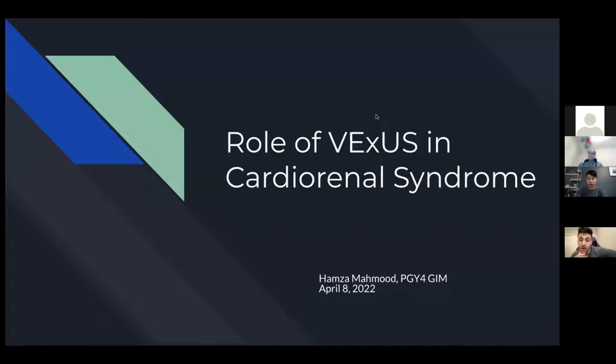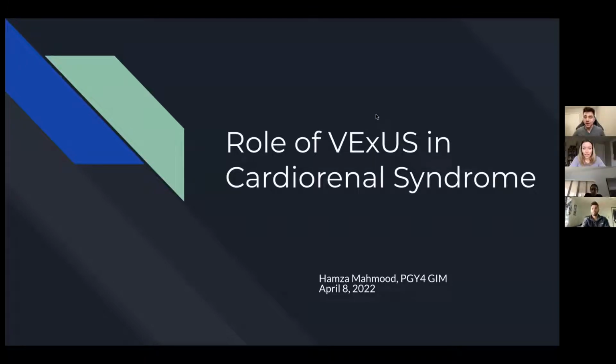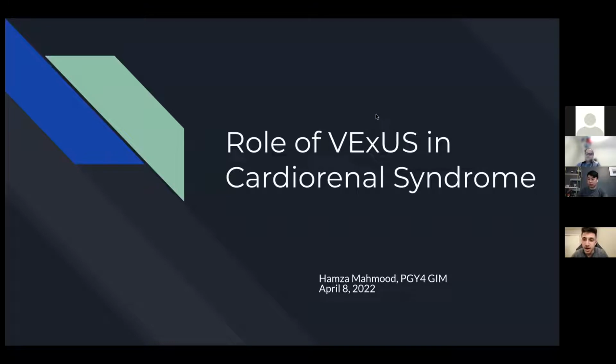For those who haven't met, I'm Hamza, as Mike was saying, one of the fellows in GIM here at Western. This is my second block of ultrasound, and I find this a really interesting area personally, specifically thinking about how we can incorporate ultrasound more into the GIM world, whether on the wards or in the clinic. So I thought this was an interesting area for my presentation. It was a great block. I got a chance to do lots of VExUS studies.